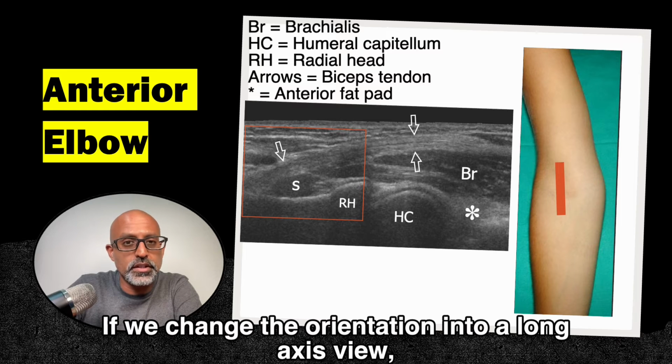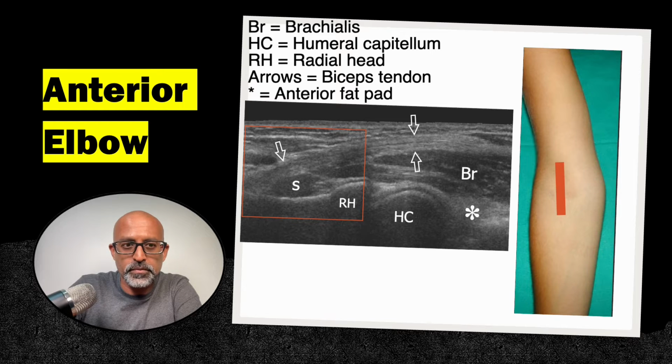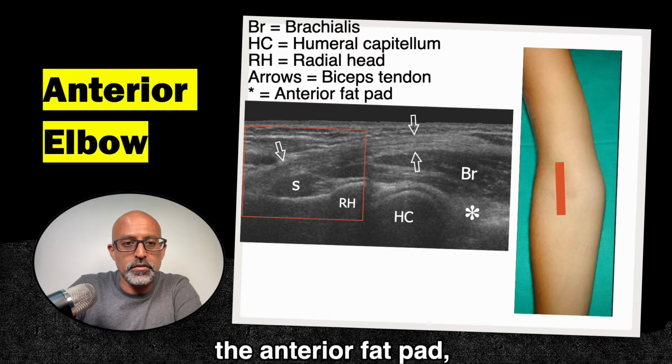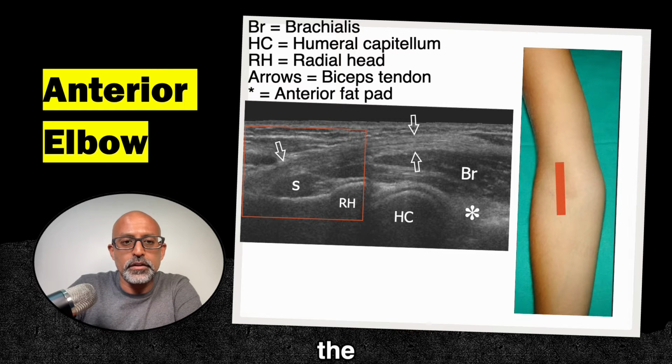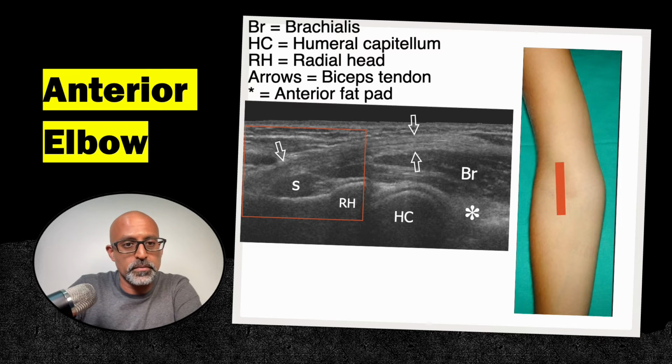If we change the orientation into a long axis view, what we're hoping to see is the biceps tendon, and you can see as it dives down onto the radial tuberosity. Other structures that we can see here are the brachialis again, the anterior fat pad, the humeral capitellum, the radial head, and also the supinator muscle.